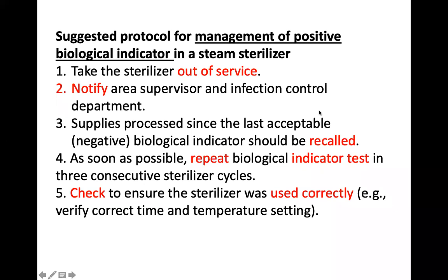Okay, so you recall, and that is why all items that go through sterilization must be properly labeled with the date and time. Okay, so everyone knows when was this batch of forceps, when were they sterilized, so that if you notice something even 3 days later, you can efficiently recall what you need to recall, okay? Because you could have sterilized them today, okay? The biological indicator gave you, yes, it was negative. But when you're carrying out an outbreak investigation, maybe there's an outbreak of Pseudomonas in the ward, you realize it is from a group of cotton swabs that came in last week, Friday.